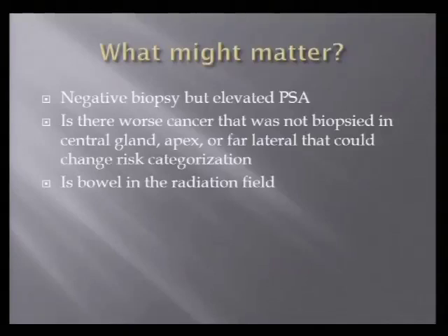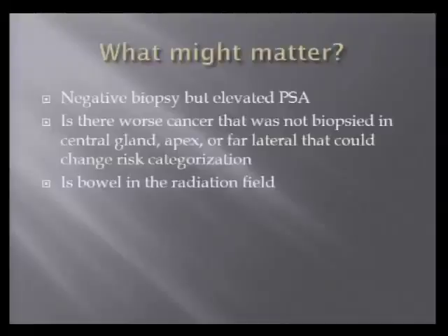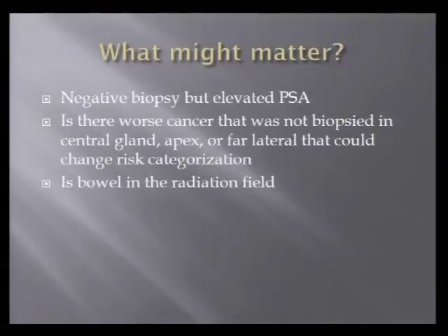So what might matter? I say might, but to me this actually is what, when I was going through this whole month, what actually seemed to matter the most. Negative biopsy but elevated PSA. I'll show you some pretty fantastic examples in just 1 month that I was there, and I'm sure if I did this for a whole year, we'd have a ton of them, where the indication would be negative biopsy, elevated PSA, and you see a really nasty looking cancer in the anterior gland. I think that's a great indication for prostate MRI, and it's kind of funny because you don't see as much written about that. I mean, there's a little bit written about it, not near as much as about the staging, but to me, that's a fantastic reason to do it, and I'll get into different case examples.